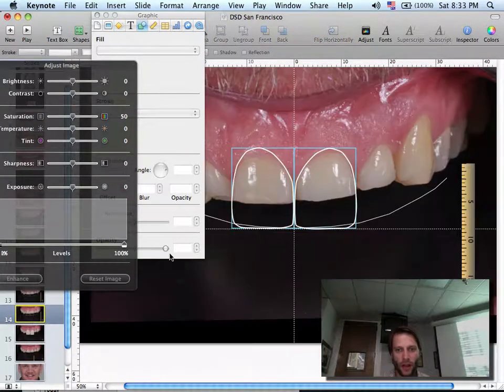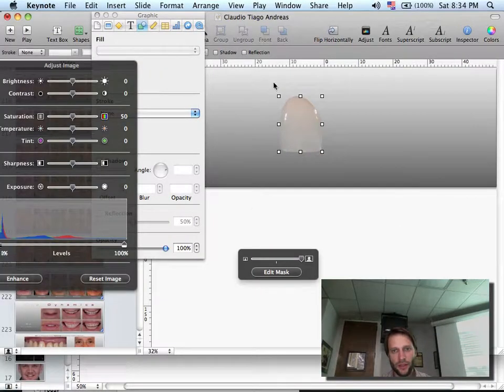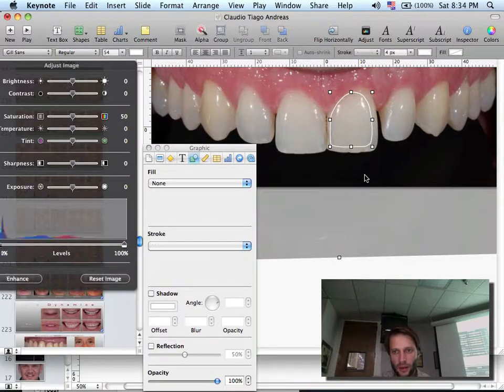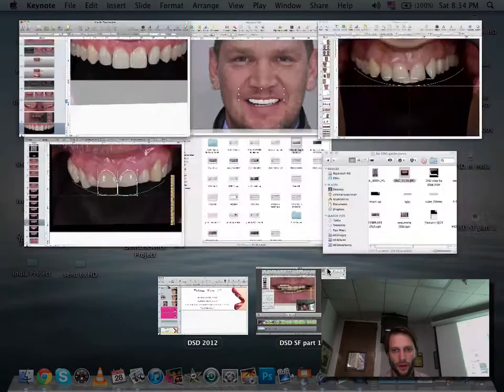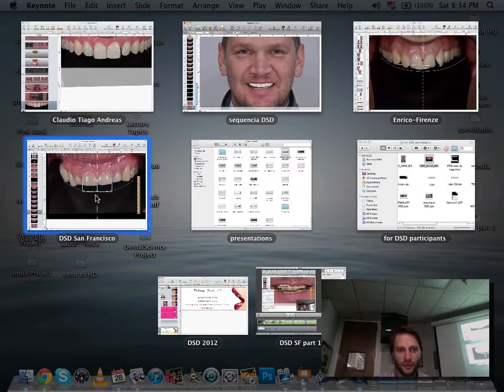So what I usually do, I come to my bank or my library of shapes, I copy it and I drag and I paste on top of a picture that has a nice dentition, like here. So I paste the shape. Once I paste the shape, I make sure that it's nice when you get some light reflection. You see these light reflections over here? Then I select the picture and I mask. So now I have this little veneer. Okay? And that's the way you can do it. Instead of just filling it with white, you can make it nicer by filling it with tooth shape, tooth color.